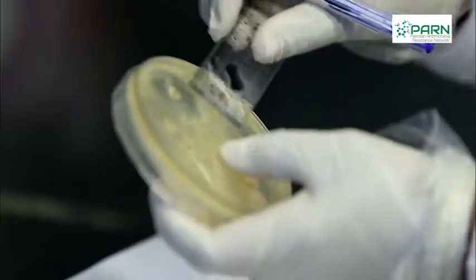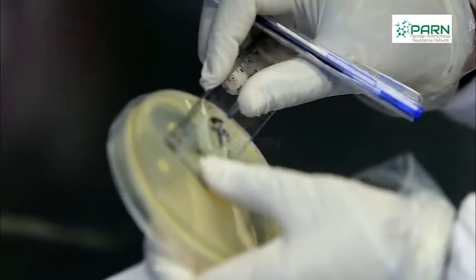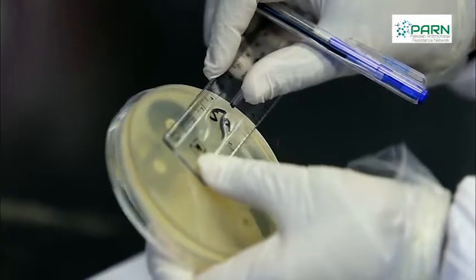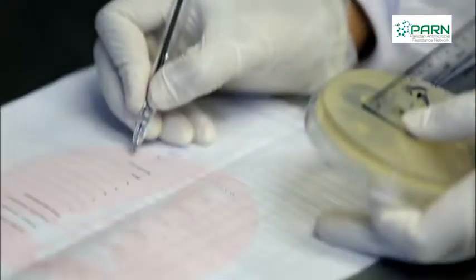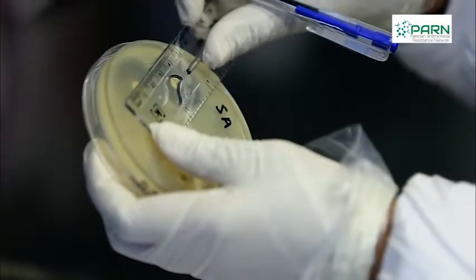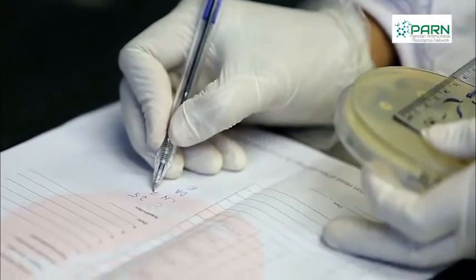Measure the zone sizes to the nearest millimeters using a ruler. Viewing the back of the petri plate, hold the plate on a non-reflecting surface with reflected light.